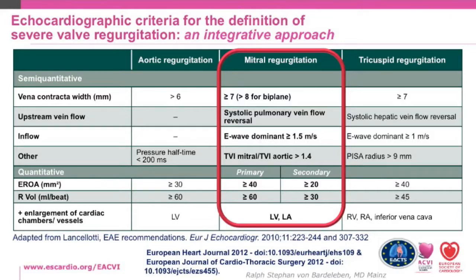This is just a shortcut to the echocardiographic criteria given in the guidelines of the valvular heart disease in 2012, and also in the EAE or EACVI recommendations by Patrizio Lancellotti, published in the European Journal of Echocardiography in 2010.